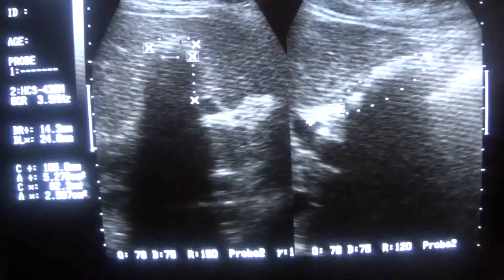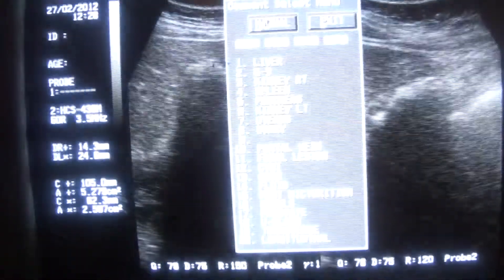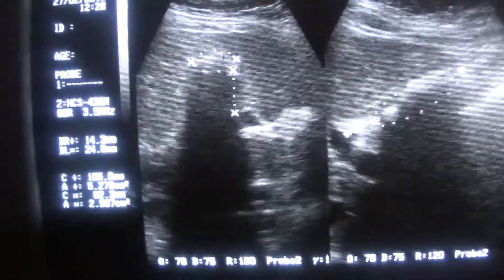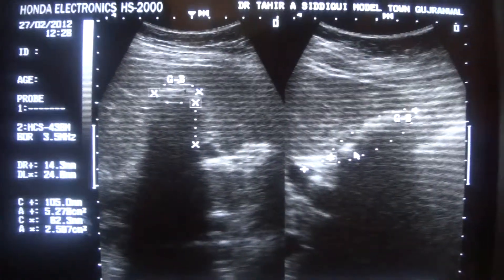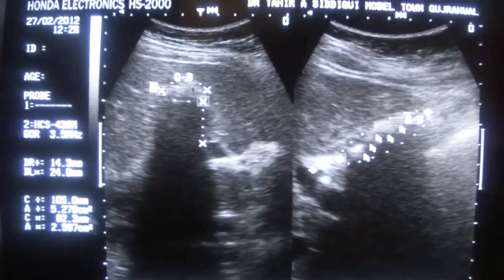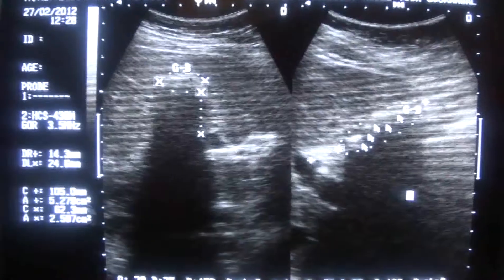So this is in fact a gallbladder that is full of calculi. No lumen is seen, walls are collapsed. This is basically a collapsed gallbladder, and these white areas that you are seeing — this is the calculus, this is the calculus — arrows are pointing towards the calculus. This is full of calculi. The relation is established with the portal vein, and this is the gallbladder full of calculi.